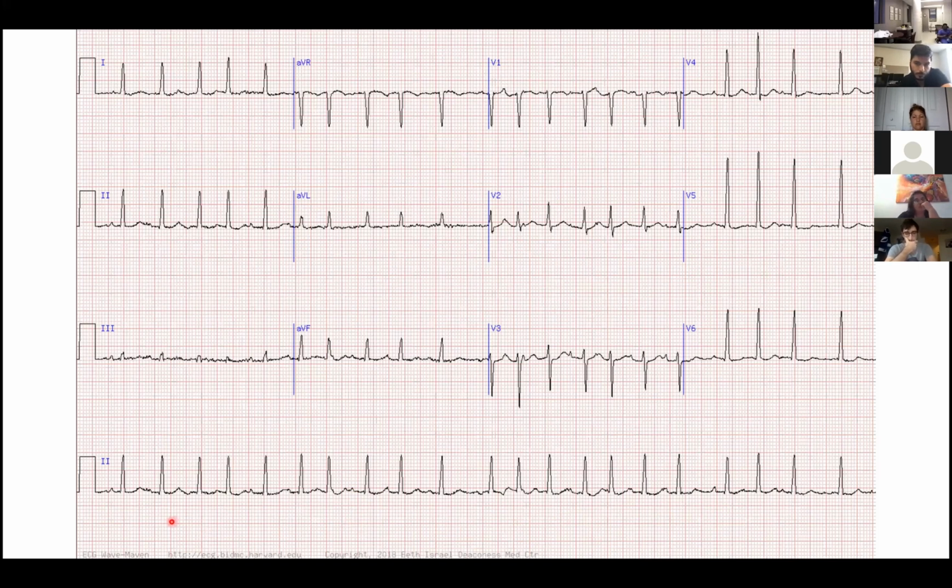So if you go by your differential diagnosis, you have AFib, multifocal atrial tachycardia, and sinus. First of all, there is a P wave, so that automatically rules out atrial fibrillation. Then you are left with these two. Sinus would have a consistent P wave. You wouldn't see different morphologies. So this could either be sinus with PACs, or multifocal atrial tachycardia. And here, given the multiple weird morphologies and a lot of irregularity, you can say this is multifocal atrial tachycardia. And that's pretty much how you reach the diagnosis.